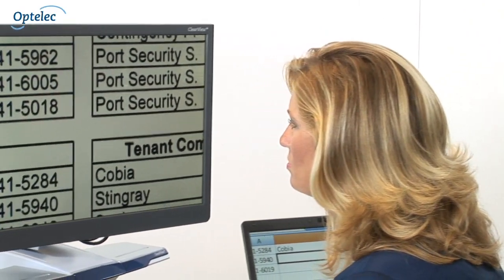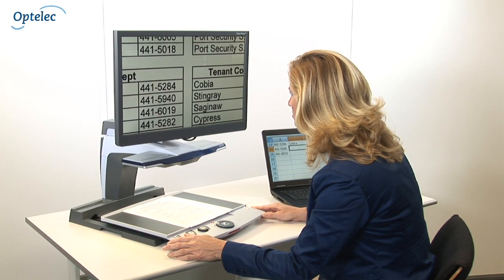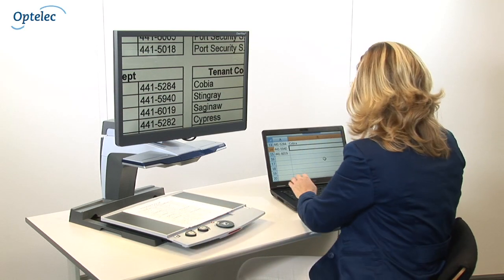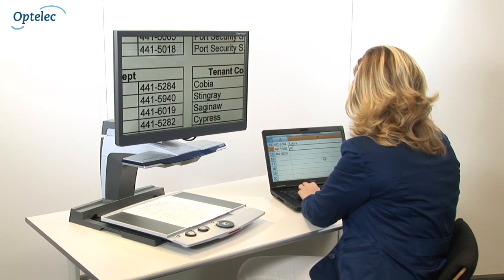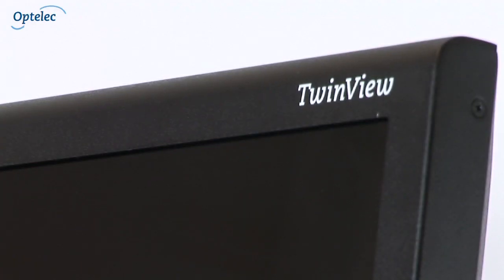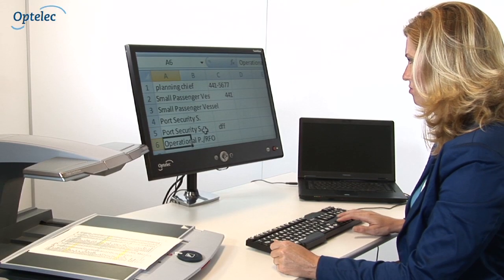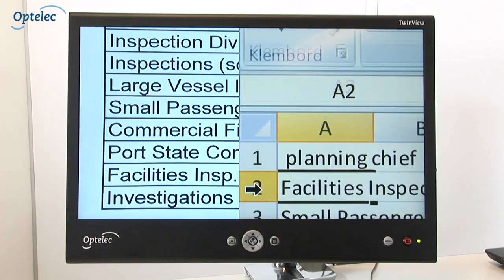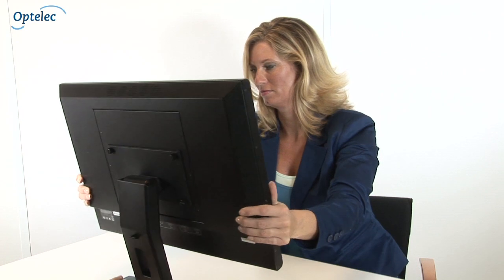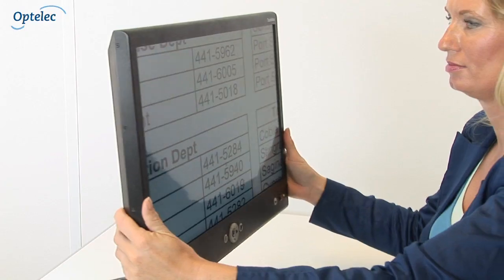Are you living with a visual impairment and searching for the perfect solution that can combine the use of your video magnifier and your computer on a single monitor simultaneously? The Optelec TwinView is a 24-inch high-definition screen specifically developed for use by visually impaired people. With the TwinView, you can work on the PC while also using your video magnifier. The wide viewing angle, brightness, and high contrast settings optimize the Optelec TwinView for use by visually impaired people.